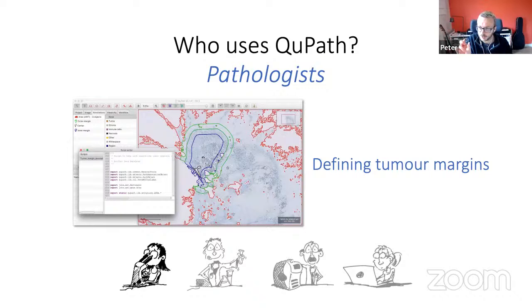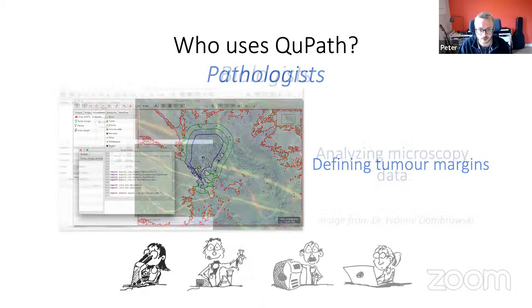And so this allows you to make more quantitative measurements, or be a bit more precise, so that you don't have to estimate by eye what, say, a millimeter would be, but you can actually define that in the image and create that kind of thing.